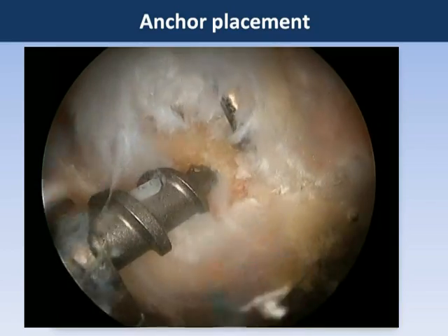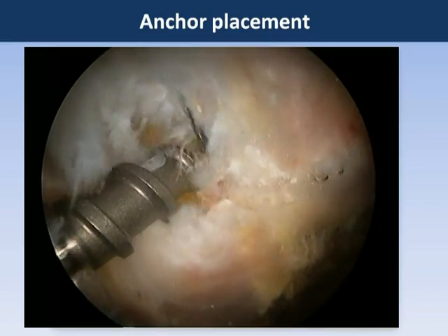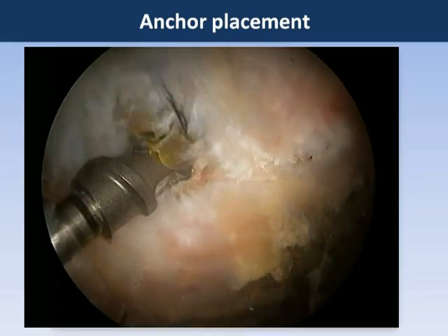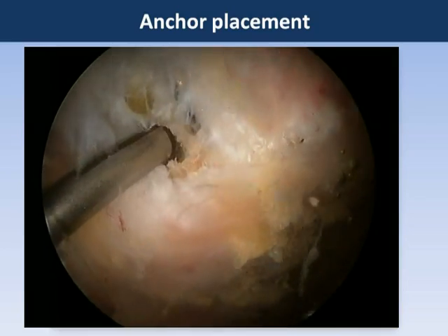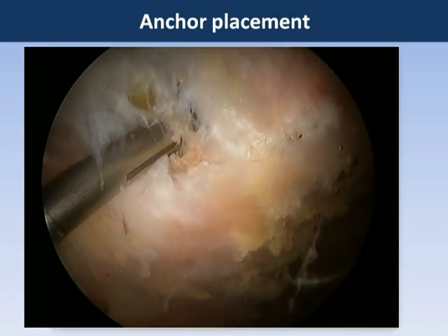The anchor will be placed into the lateral facet of the greater trochanter through the transtendinous split. This can be done under fluoroscopic guidance to ensure correct angle of anchor placement and that the anchor will be placed in good bone of the femur. Usually two anchors are placed — one in the more distal part of the lateral facet and one in the more proximal part — and these will be used for a side-to-side mattress repair.